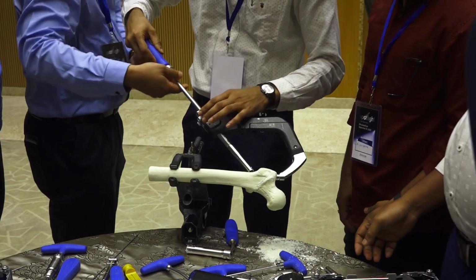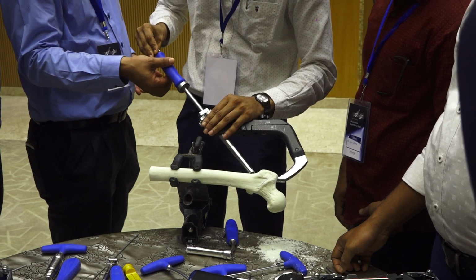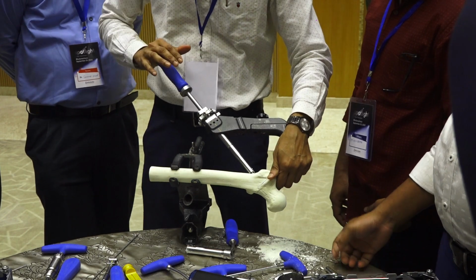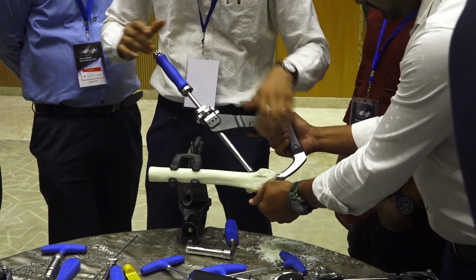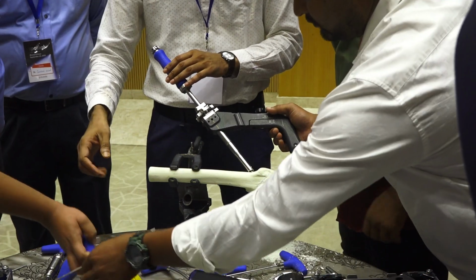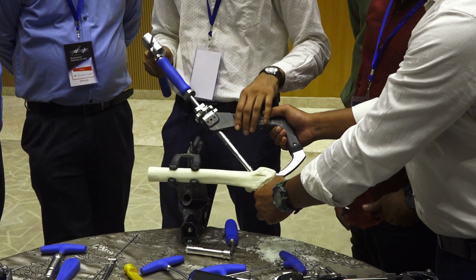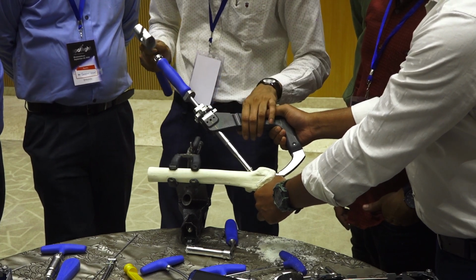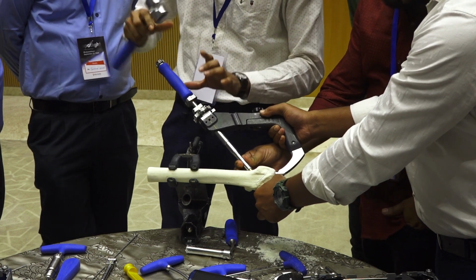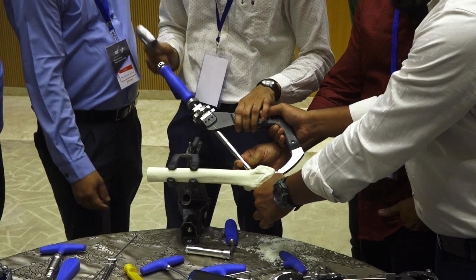Match this red to red, then only it will go. So it will go automatically. Now anti-clockwise, it will go like this. So you try to push it with hand as much as possible. Then you take the hammer and hammer it, gently tap it, under C-arm control. And here there is a stopper. It will go up to that distance only. It will go rotating like this and compact the bone.